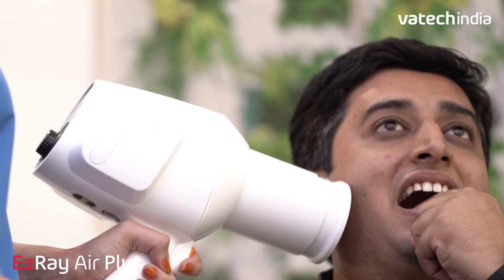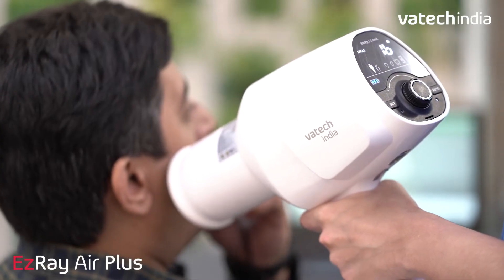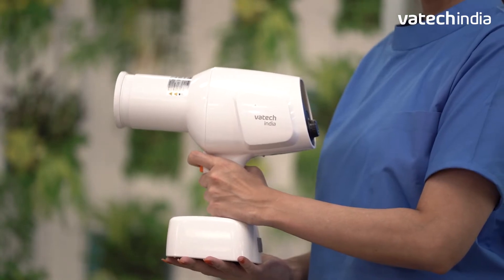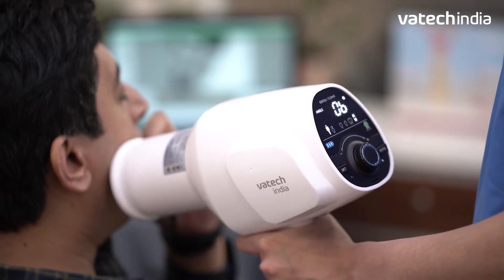EZ-Ray Air Plus has a longer cone, designed to keep you and your patients safe from radiation. The gun-type unit allows easy positioning and single-handed operations, reducing the need for an assistant.